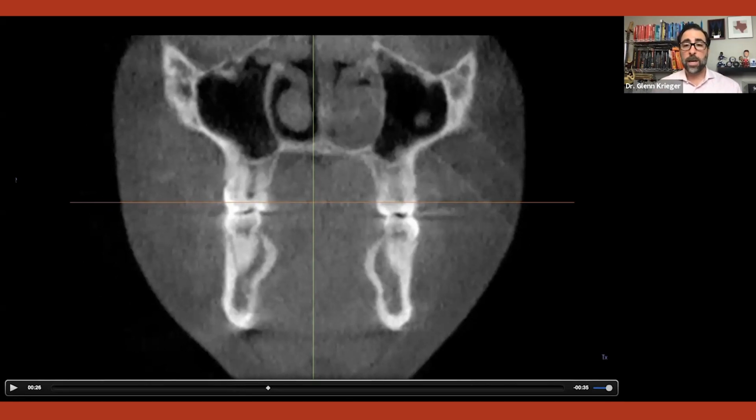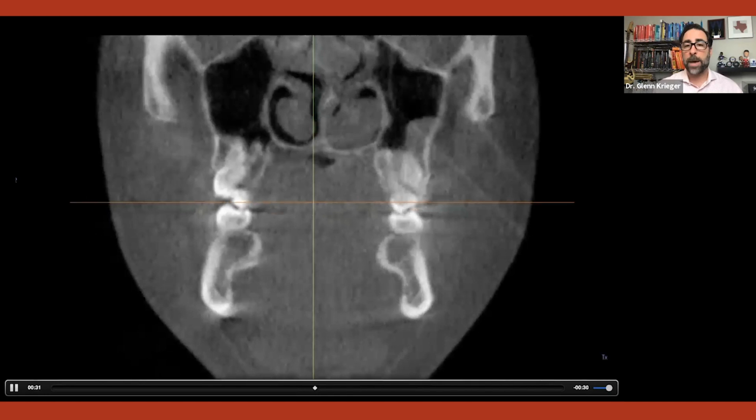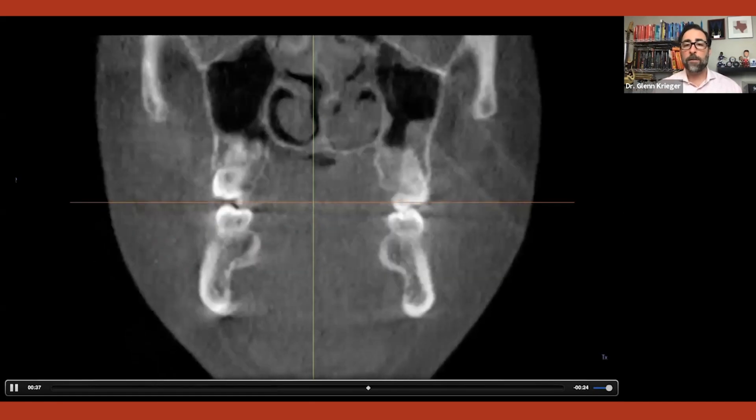The physicians never said a word because they don't have this view. Pediatrician never said anything. Nobody's ever said a word to this child or mom about how we can help this child potentially breathe better. Now, you're not hearing me talk about jumping to treatment plan with what we need to do. I'm just saying, look at the floor of that nose.